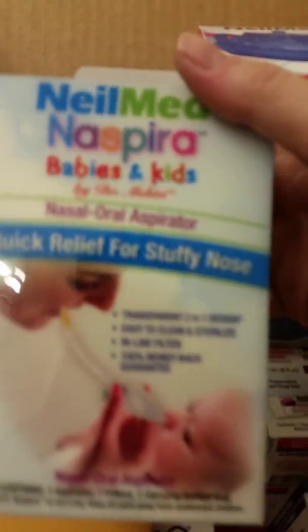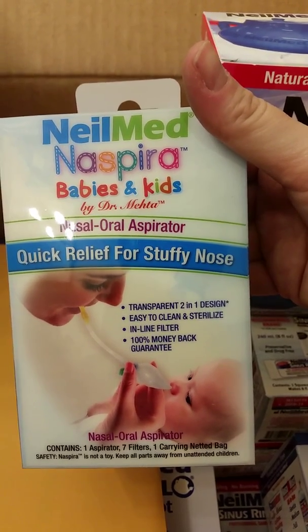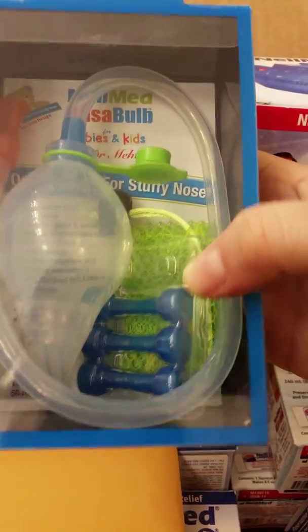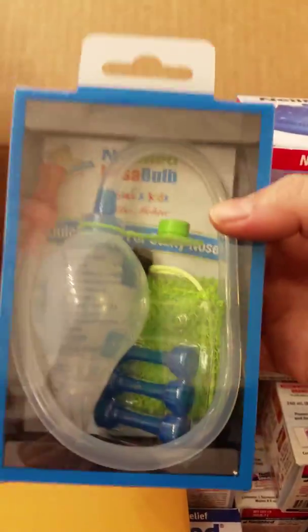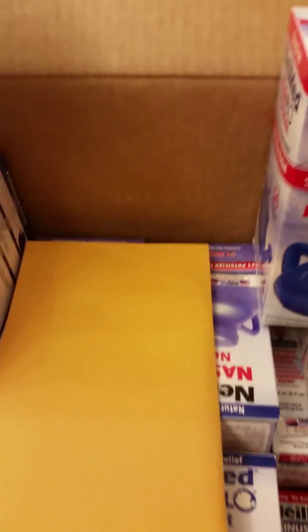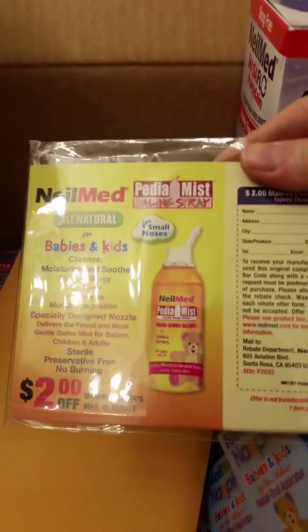There's also these, which I would compare to a NoseFrida if you know what that is. We have four of these — here you go, you can see it. It's got this piece and a cleaning bag. I've wanted one of these ever since I had my second child — actually probably my first child, because he had RSV when he was young and it was hard to get the mucus out of his nose.